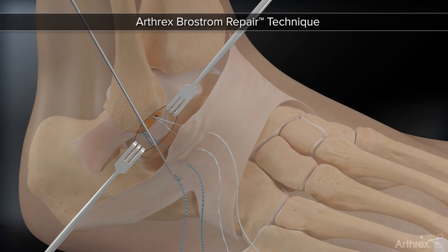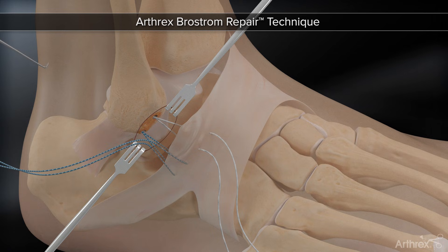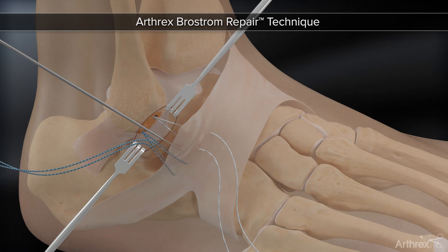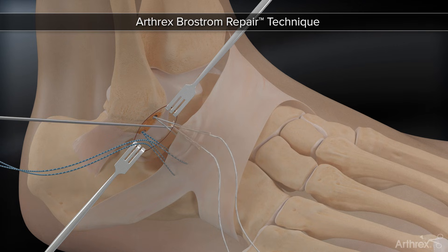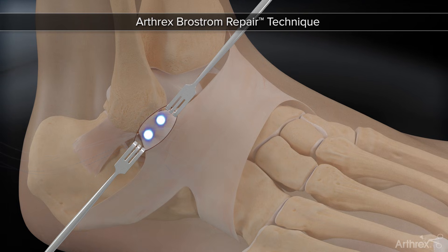Using an arthroscopic probe or a hemostat, subcutaneously retrieve the four sutures through the small incision. Finally, while holding the foot in neutral and slight eversion, tie the sutures tightly down to the fibula.